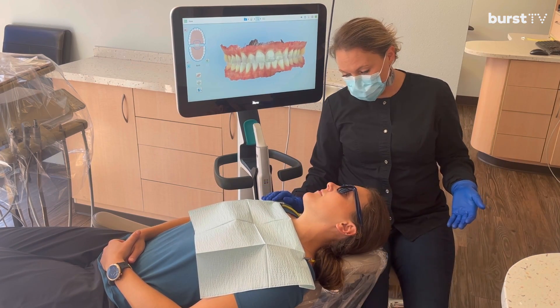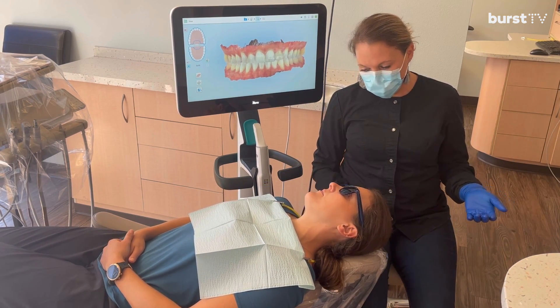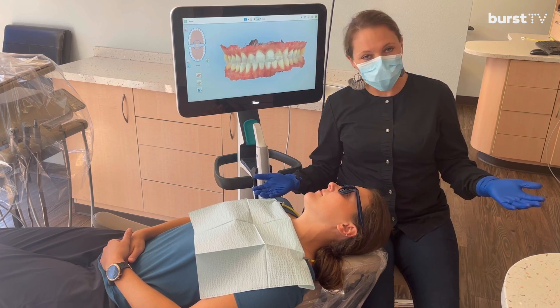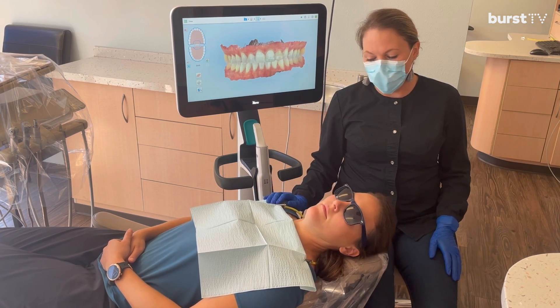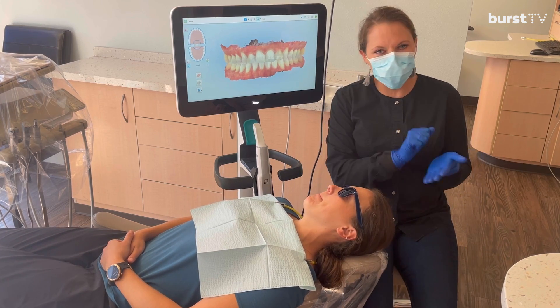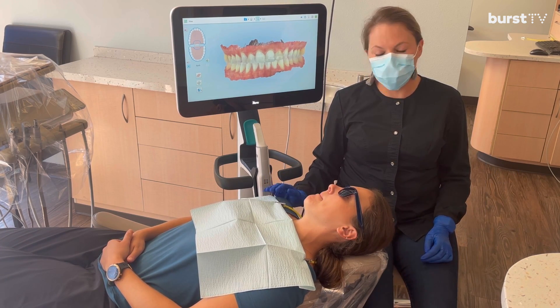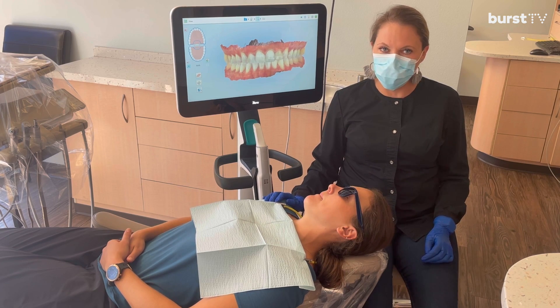How was that comfort-wise? Really good. Light touch — as with everything in hygiene, you don't want to press on the teeth, you don't want to press on the cheeks. But it tends to be a very comfortable experience for patients.